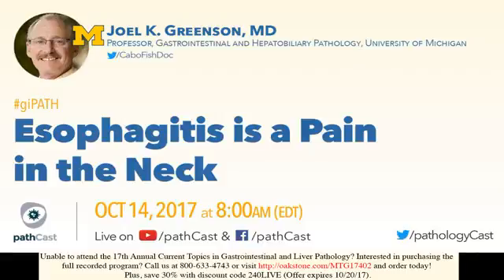Yes. One of the things I think, when people have reflux, you get some cardiac mucosa in the biopsy. Sometimes you may see something a little more distal. Cardiac mucosa is inflamed as well as the esophagus. And I kind of learned to associate that with reflux.